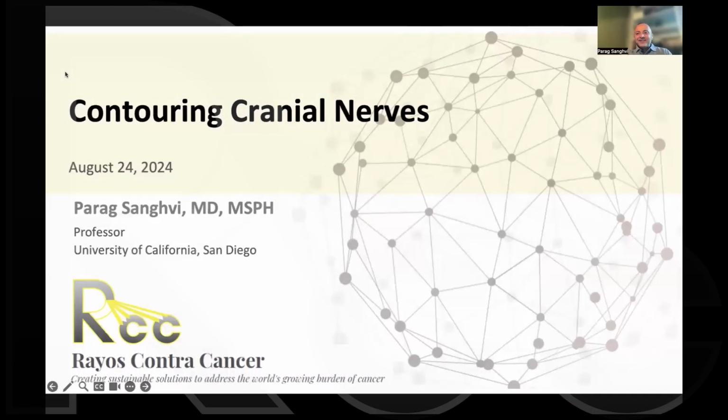I know you've had some very busy weeks learning about nodal contouring and postoperative oral cavity contouring. And so we're going to switch topics today to talk about contouring cranial nerves.